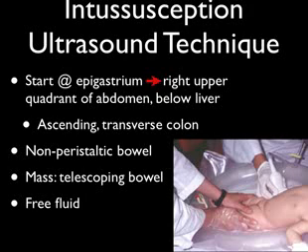The way you do this, and this is an example here, is placing the patient in a warm water bath and holding the legs together as we're doing the ultrasound. By holding the legs together, specifically by squeezing the buttocks together, that can actually help reduce some of this and fix the problem.